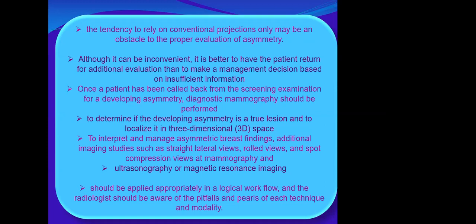So, although it can be inconvenient, if you see that on screening mammography, just recall the patients and base your management on sufficient information. Don't take it lightly.